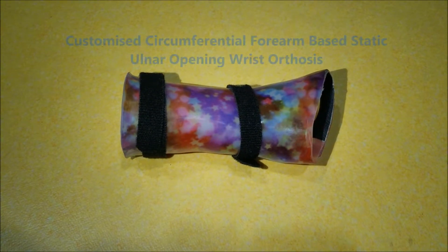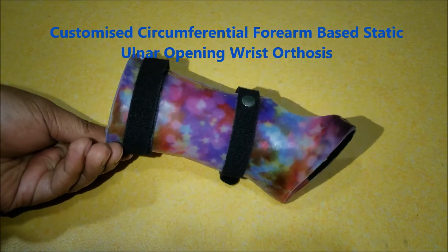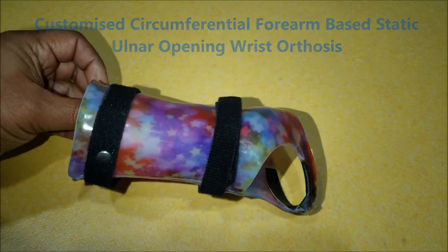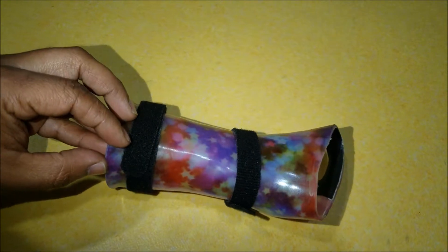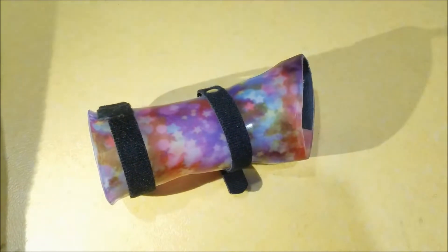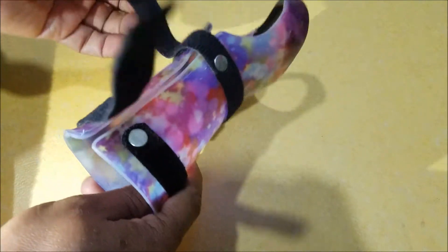This is a customized circumferential forearm-based static ulnar opening wrist orthosis. It is generally known as a static wrist support and circumferential working splint, as this splint allows you to perform daily activities. This orthosis is made up of super flexible polyethylene.